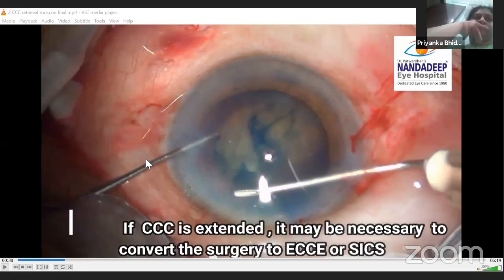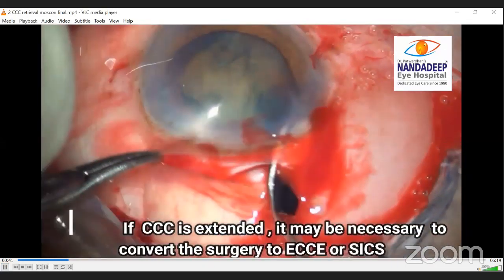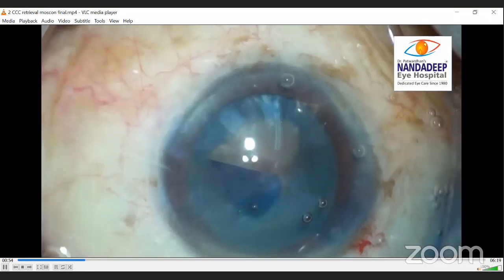Okay. So, as we all know, CCC is very essential for doing phaco, and particularly for young surgeons. I think once the CCC is extended, we don't proceed with phaco because there is an obvious chance of the rhexis extending further and nucleus drop. So we have to somehow complete the capsulorhexis. So there are a couple of maneuvers which are of use when your capsulorhexis is trying to extend. First, a very famous and very useful maneuver, it is called Little's technique, described by Brian Little and his colleagues.